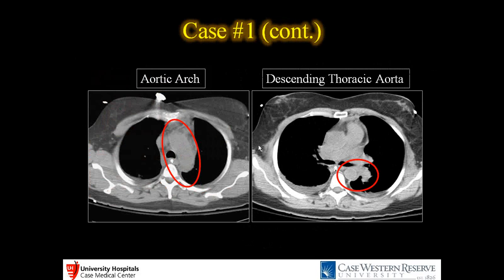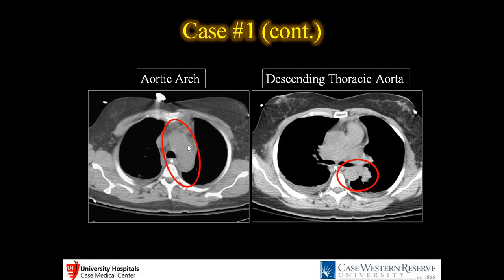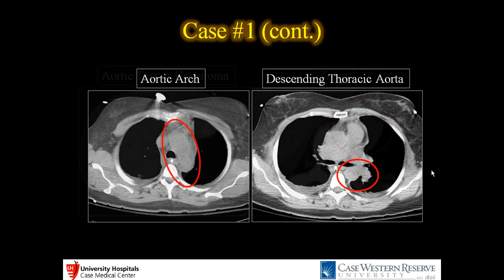Okay, in this preoperative study, in a CAT scan, we can see around the aortic arch that it looks like some extravasation of fluid versus edema. And over here at screen right, this is a cut of the descending thoracic aorta, and there's actually extravasation of dye around here, also indicating some possible disruption of the aorta.